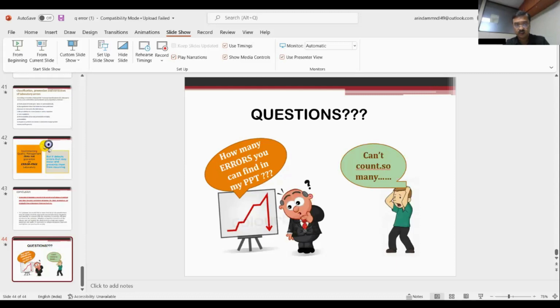So he is saying there is constantly low sodium in our lab around 130, but QC is passing daily. So are you evaluating whether your QC is passing daily against the pack insert mean or a lab mean? Sometimes it might so happen that with time, the lab mean decreases gradually, unknowingly, and comes to a range where you are getting low results, but the lab mean is still showing that your precision is okay.